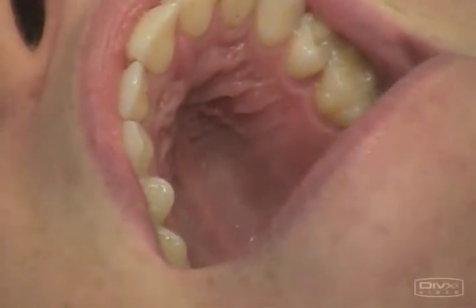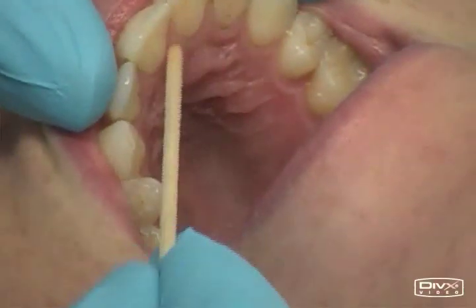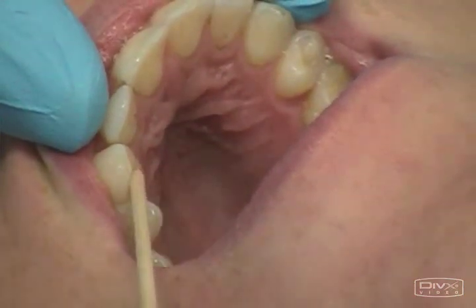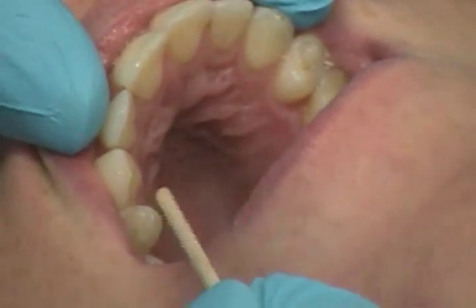This is the nasopalatine nerve block. The nerves are the nasopalatine nerve bilaterally. Areas anesthetized are the anterior portion of the hard palate, the soft and hard tissues, from the mesial of the right first premolar to the mesial of the left first premolar.